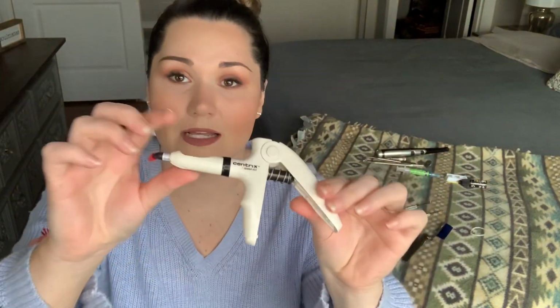So this is a composite gun. There are different shades of composite, so you need to make sure that you grab the right shade. They are labeled right here if you can't see that. This is A1, this is a very light shade. So you want to make sure that you grab the correct shade.